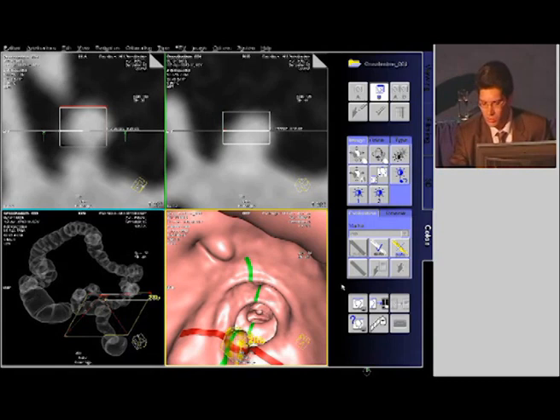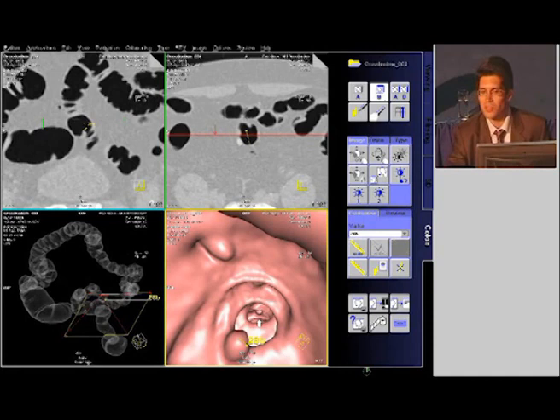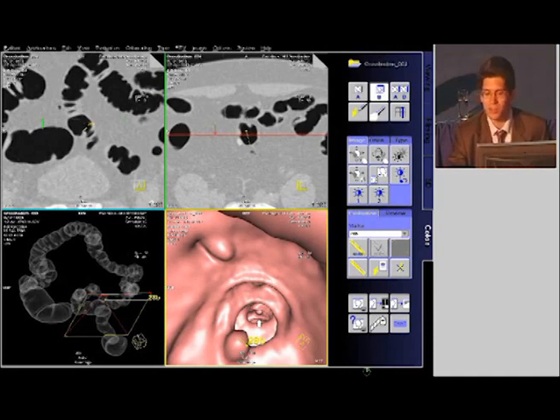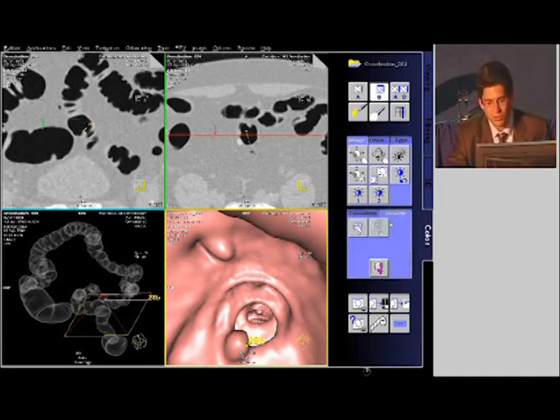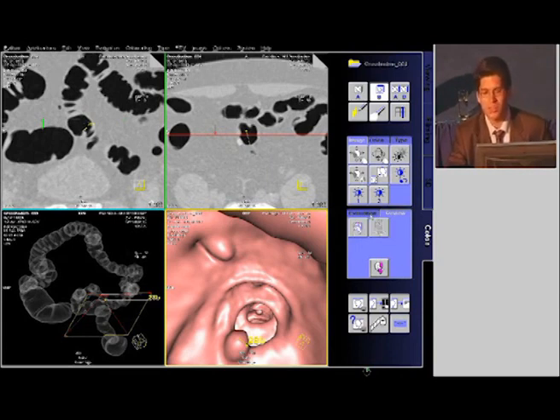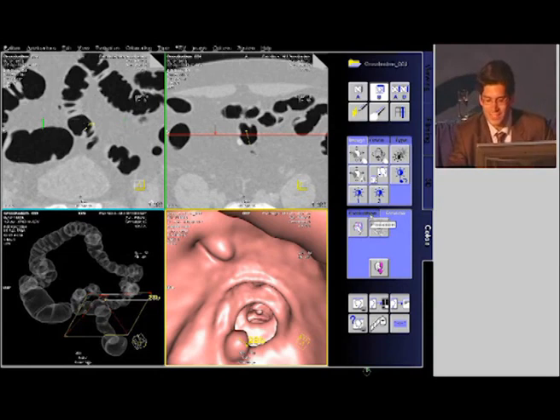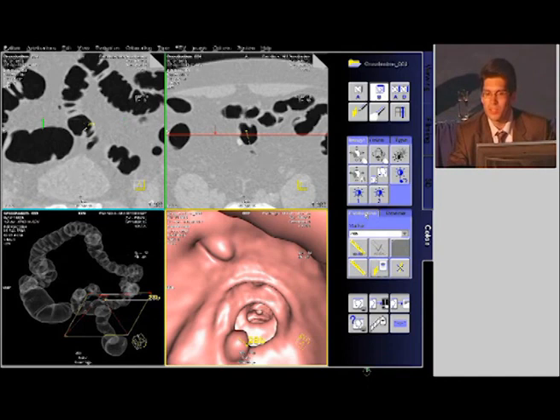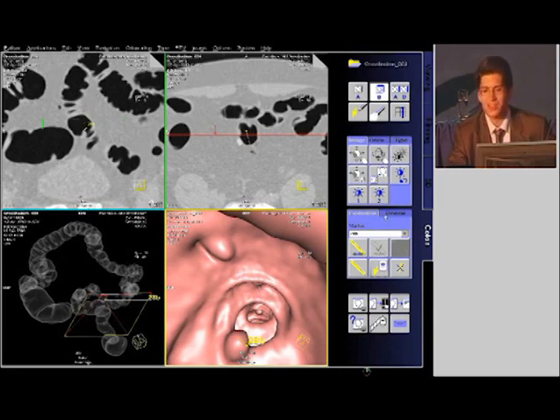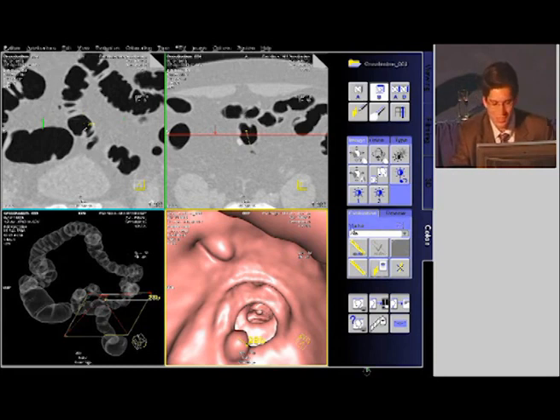This is actually a tool which will also allow you to do a follow-up. While I'm talking, the polyp-enhanced view tool has been running in the background. If you go to RevView, you can see this button here which starts the polyp-enhanced view tool, which is the computer-aided diagnosis tool in virtual colonoscopy. The tool itself takes about four minutes to do a calculation of the whole colon and look for polyps — less than five minutes and it is actually a pretty good tool.